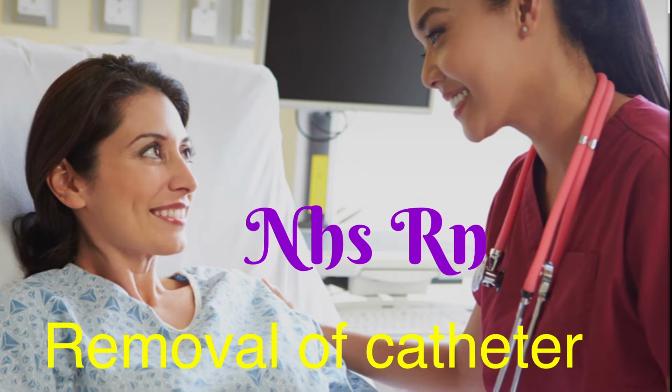Catheter removal is a 12 minute station. Yeah, this station takes 12 minutes. So whenever you prepare, try to prepare in 8 to 10 minutes. This is a little bit easier than before. So let's go to the steps.